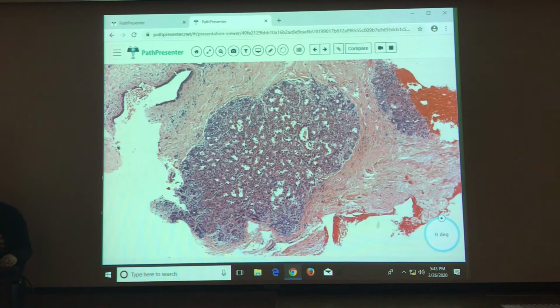If you had a patient who had been breastfeeding and is no longer breastfeeding, then as this involutes, you see a lot more lymphocytic infiltration. That again can make you worried: am I looking at a microglandular adenosis, or even some lymphocytic lesion?